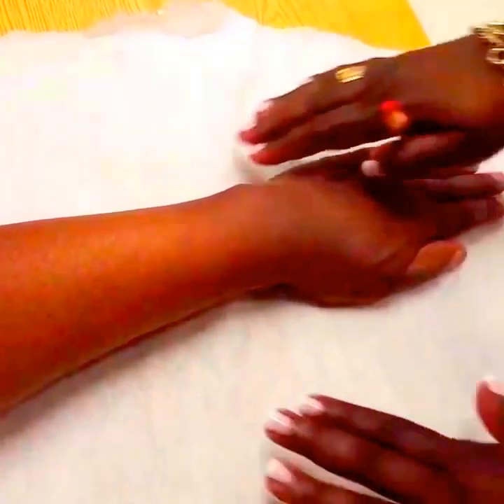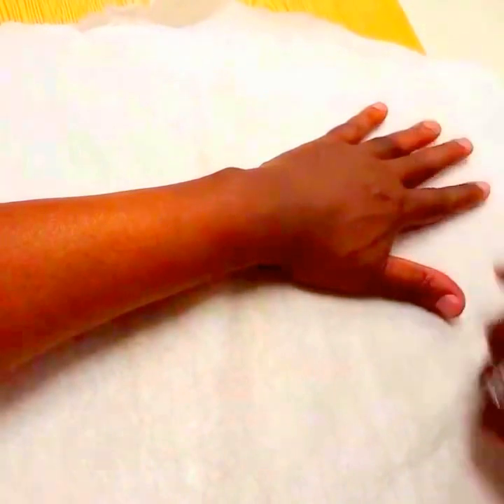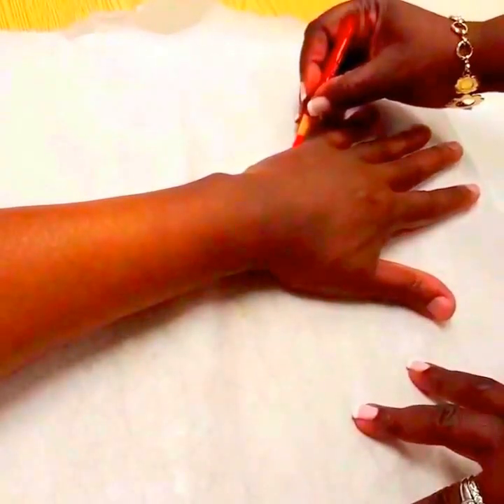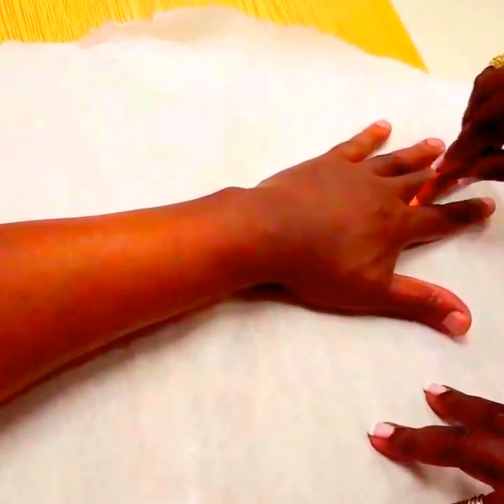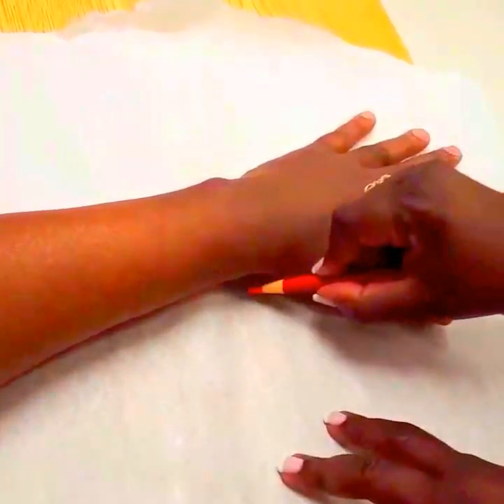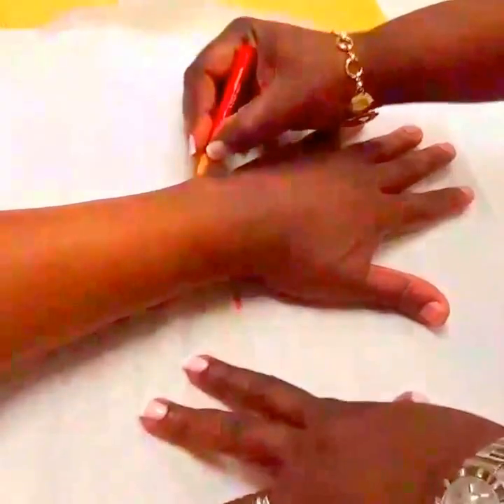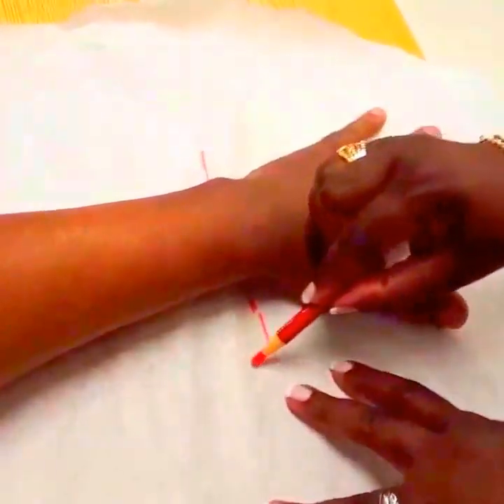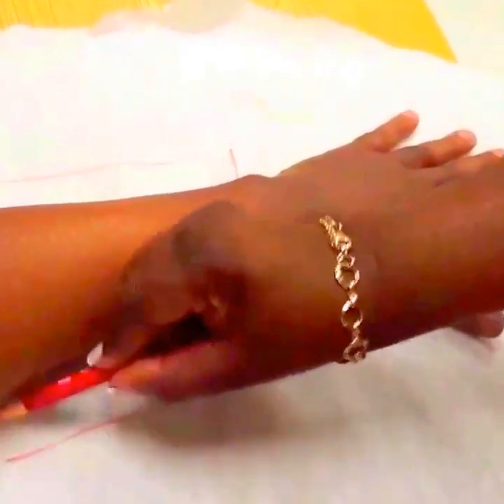First, you want to make sure that the patient's hand is positioned firmly onto the paper with the wrist in neutral. Then position the fingers so you can clearly make your marks. The first mark is going to be at the MC head of the index finger, the second at the MC head of the fifth digit. Draw a line through the second web space, then mark the radial styloid and the ulnar styloid. You want to make sure that you extend your pattern between a half inch to an inch so that it will come up midway the width of the trough or the forearm, and make sure you mark out two-thirds the length of the forearm.